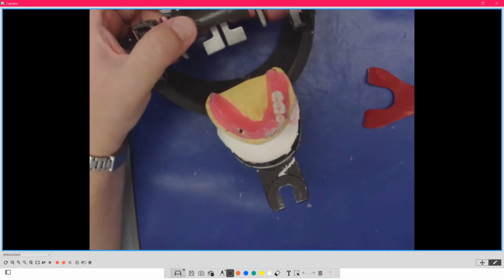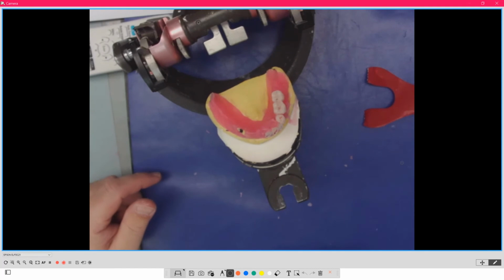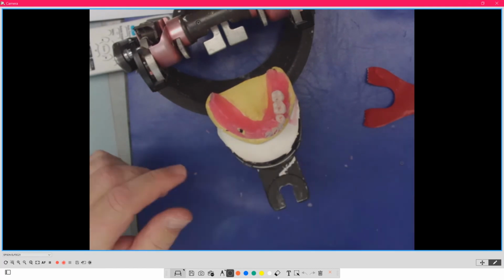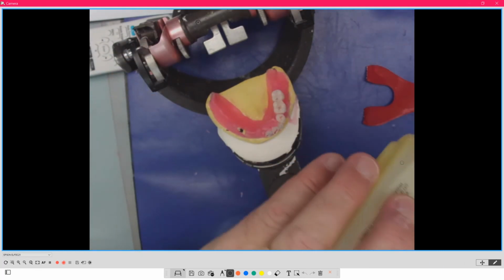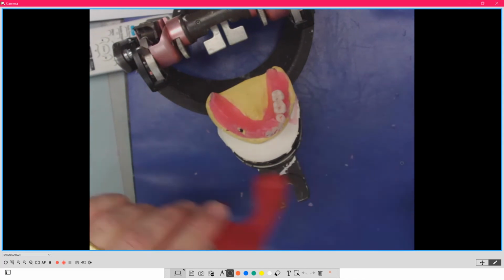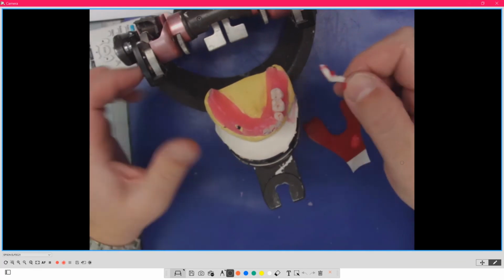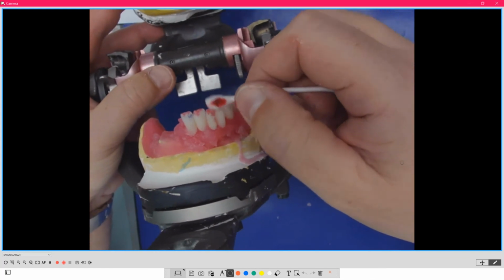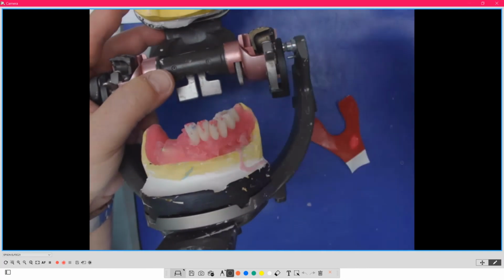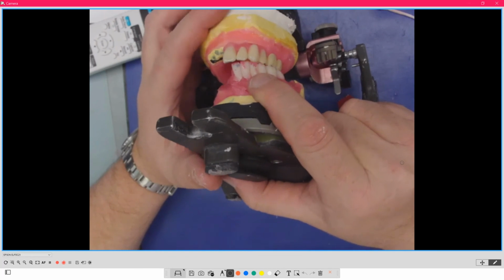lab. Or, there's always an or, I take a cotton swab, or a Q-tip by brand name, and I coat it in some petroleum jelly or Vaseline. And then I can color the Q-tip, and then I can color the teeth. So then I'm just using the ink, and I can come in and color, and then I would introduce that into the patient's mouth and get them to function and talk and chew.